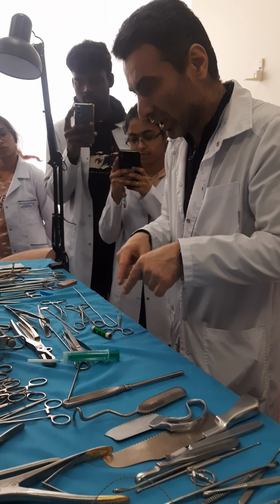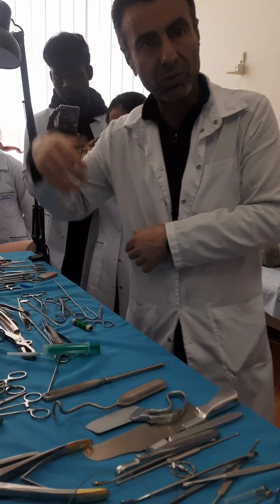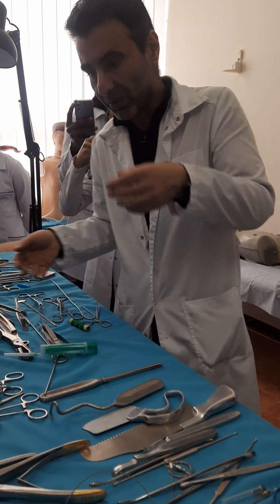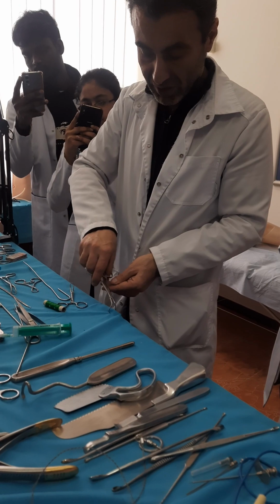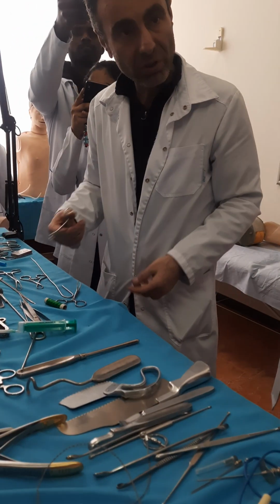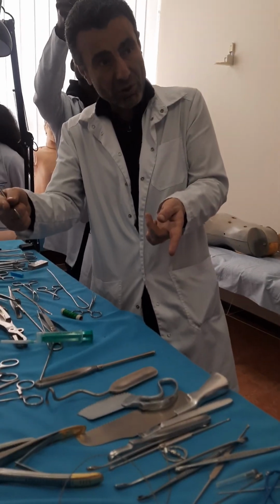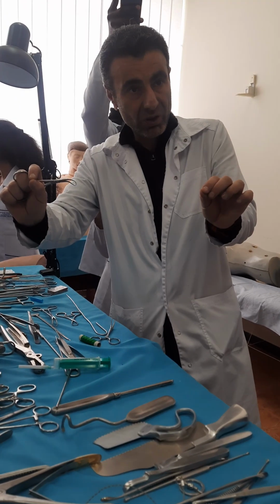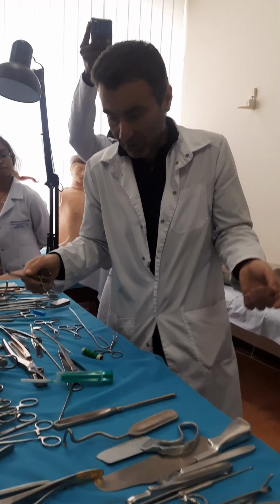Between them you make the quadrangular shape, the surgical field, which needs to be clean, aseptic, antiseptic, for some manipulation. These towels you clip to each other using this instrument. It is very sharp and pointed. If there are 4 towels, 4 clips you will use. In the angles between these towel attachment places, you will apply the clip and fix the towels this way.